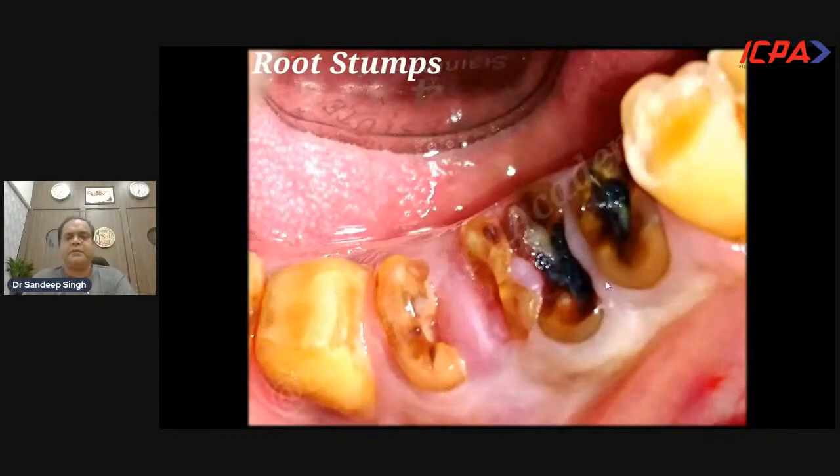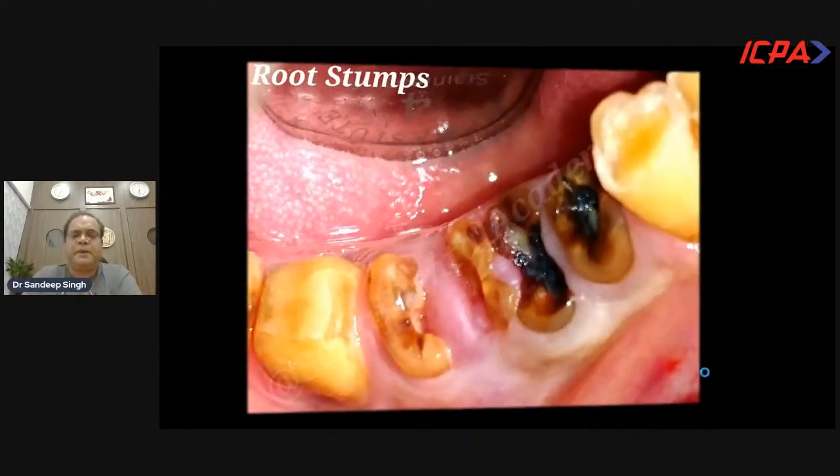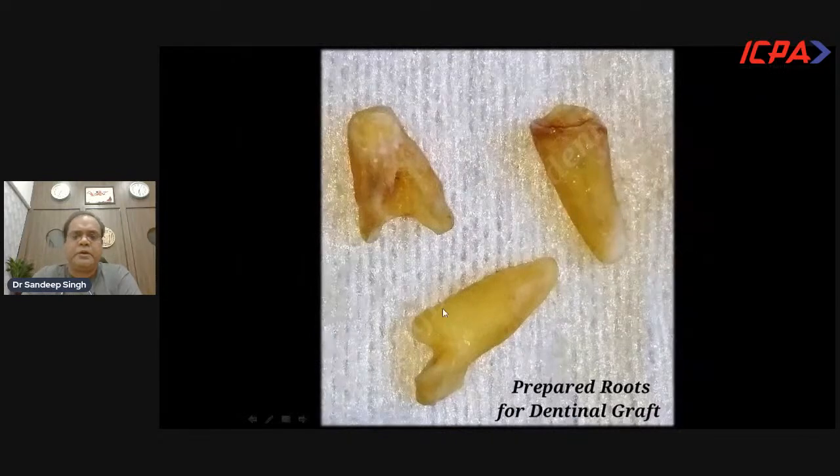references, and now I'm coming to my cases quickly because we have little time left. So this was my first case, and here you can see the root stumps, and they were taken out, and they were endodontically treated. So I tried to remove the gutta percha also, but you will see later that there were little remnants of gutta percha. I will not advise that, but still, if there is no tooth and all you are taking out is endodontically treated, you have to give a little more time, 5-10 minutes more, to ask your assistant to remove the gutta percha with a long tapered burr.